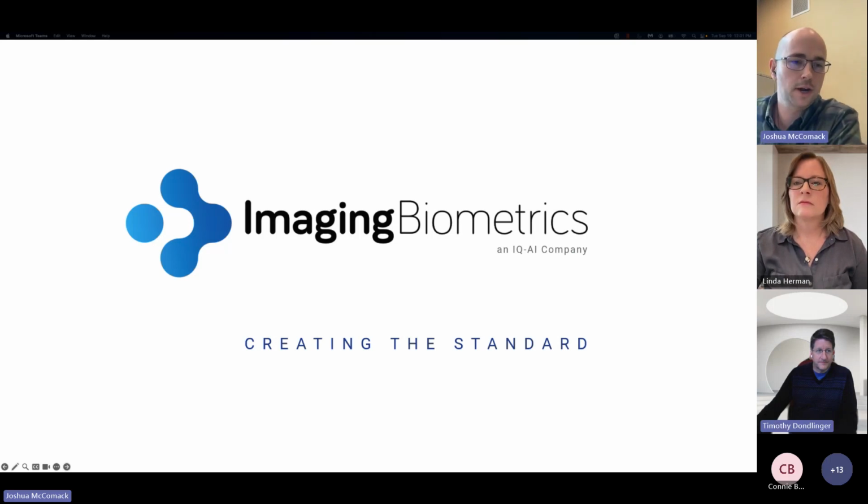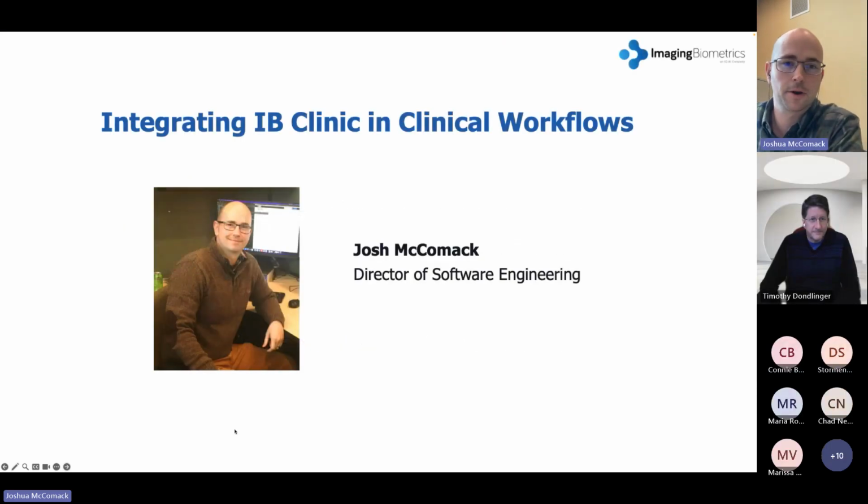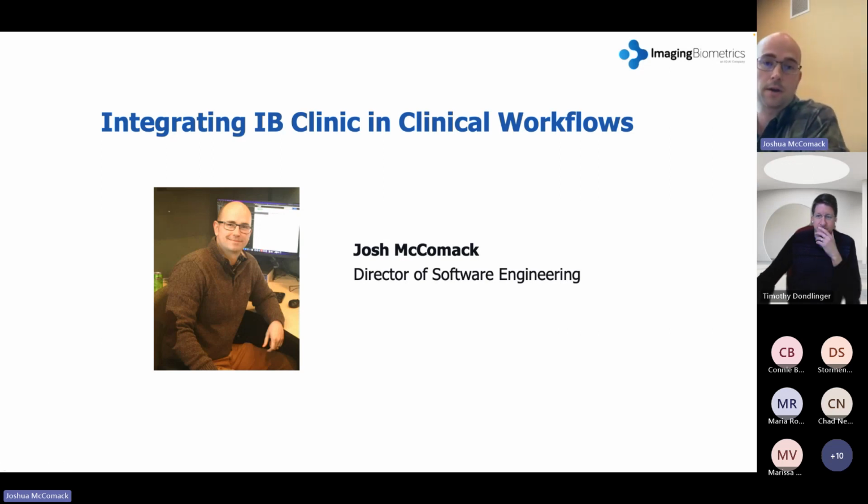My name is Josh. I actually recently was promoted to Director of Software Engineering, so that's exciting news. Before we get into the technical weeds on how we actually integrate our software, Tim, our CTO, is going to give a quick background on what some of the output is and how it's useful, and then we'll dive into those weeds.